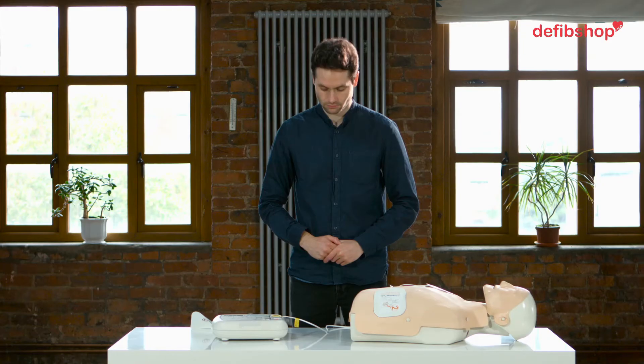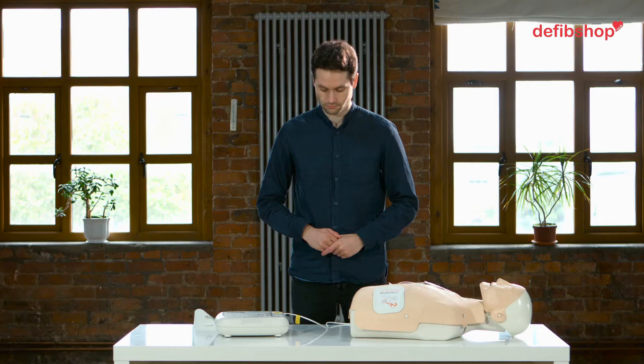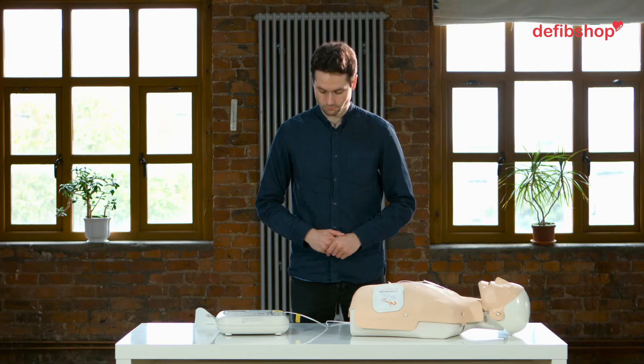Analyzing heart rhythm. Shock advised. Stand clear. Press the flashing orange button now. Shock delivered. Be sure emergency medical services have been called. You may touch the patient. Begin CPR now.